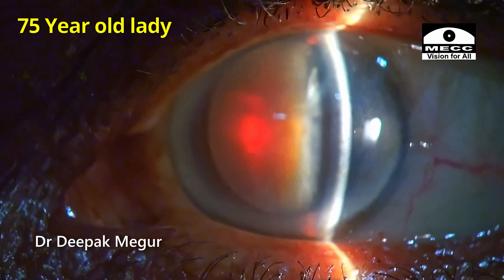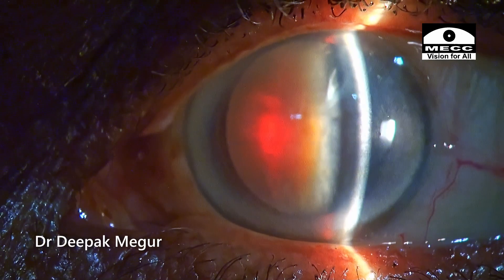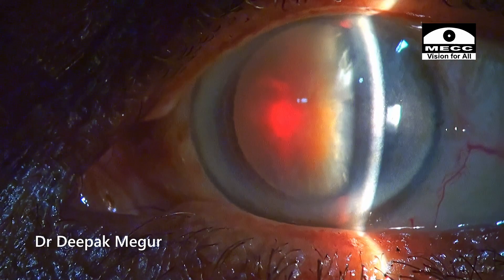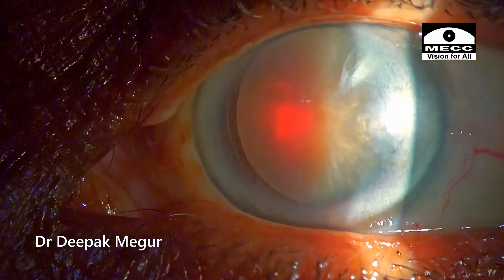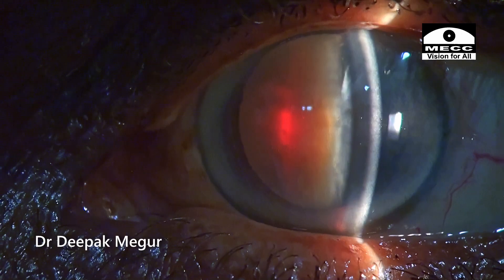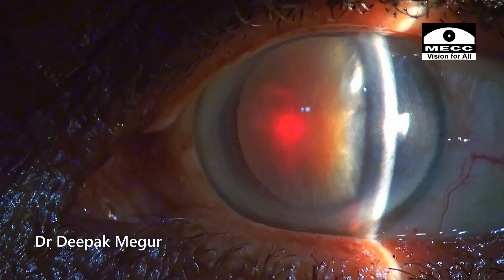This is a 75-year-old lady with a hard nuclear cataract. She has a thick Arcus senilis. Such elderly patients might not have the best functioning endothelial cells, so we need to be a little bit careful. In my experience, eyes with broad and thick Arcus senilis are more vulnerable to develop Descemet's membrane detachments at the incision sites, so I need to be mindful of these factors as I begin my surgery.